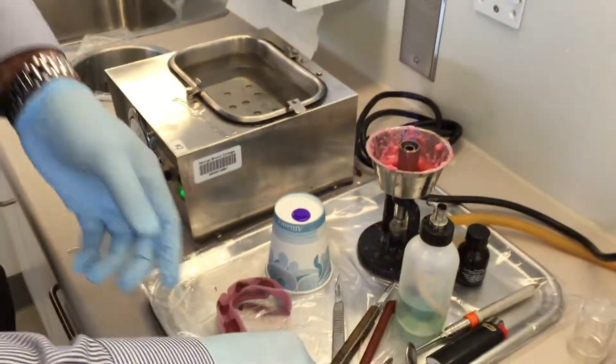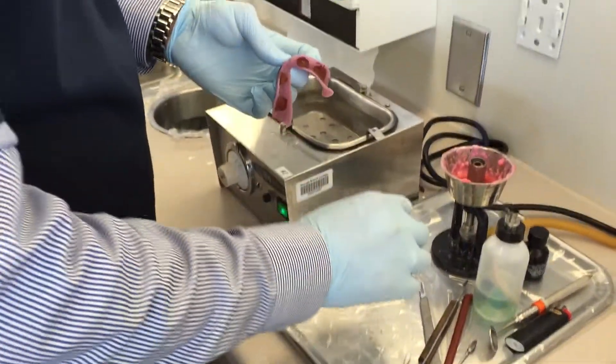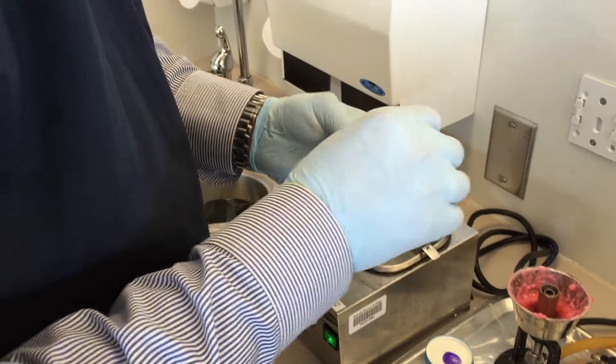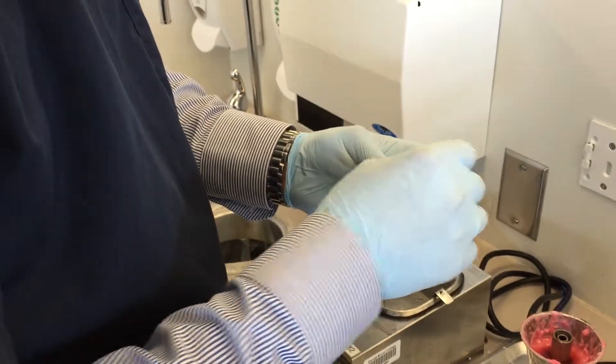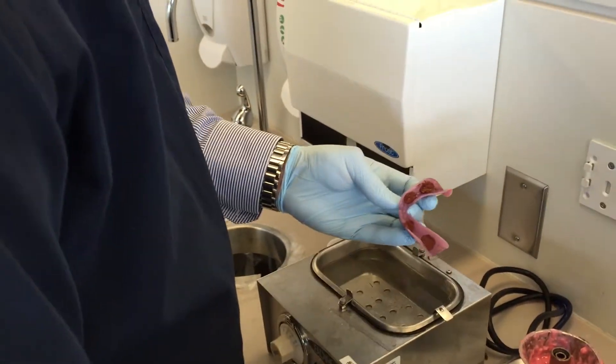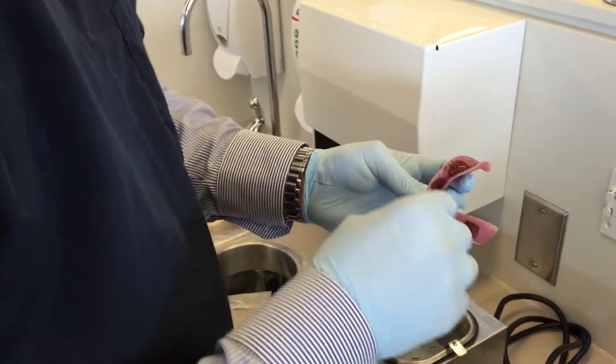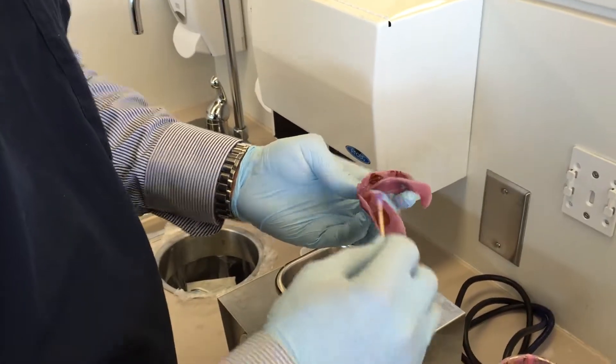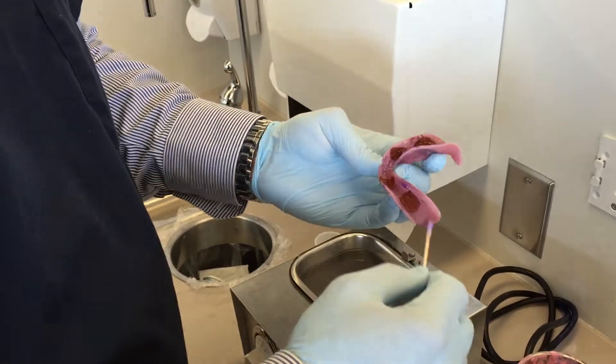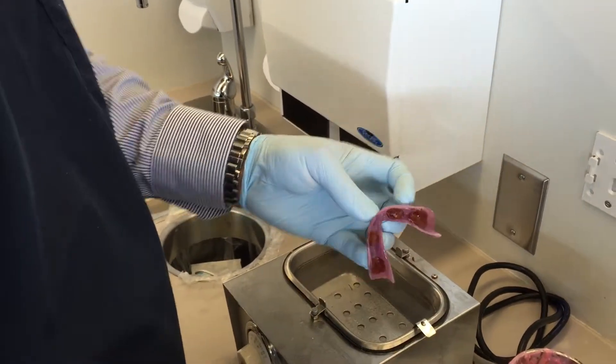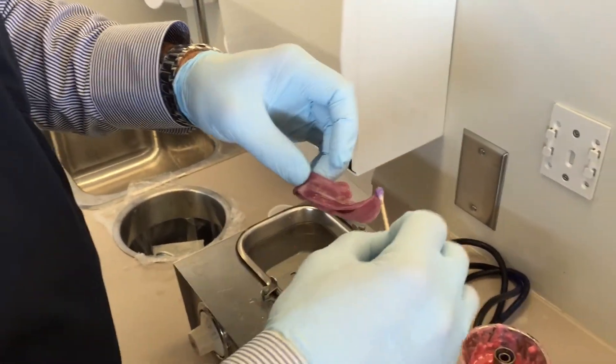And we're going to use the tip of a Q-tip to smear the material around to create a nice bond between the PVS as well as the tray.